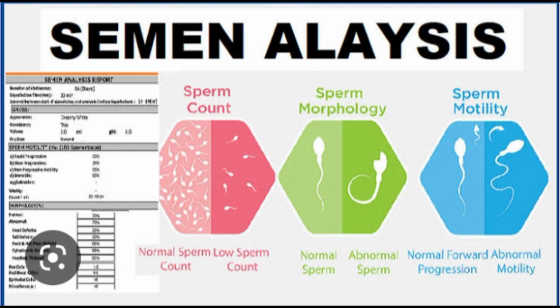The proportion of motile to immotile sperm should be noted. Insert black paper with a small square cut in the middle in the eyepiece of the microscope. If motility is very low, repeat the examination. Count at least 500 spermatozoa and give the average percentage. Immobile spermatozoa are counted after the motile ones. The duration of motility should also be studied.